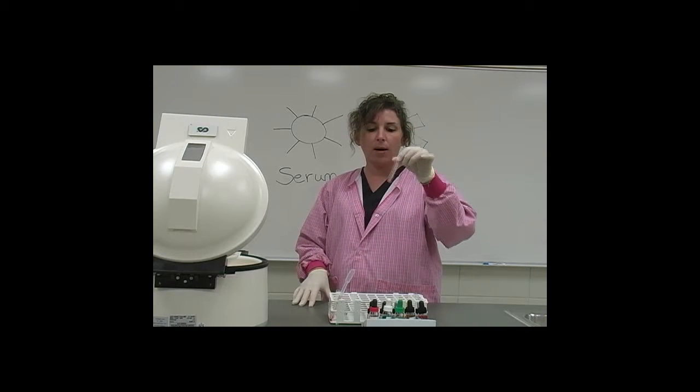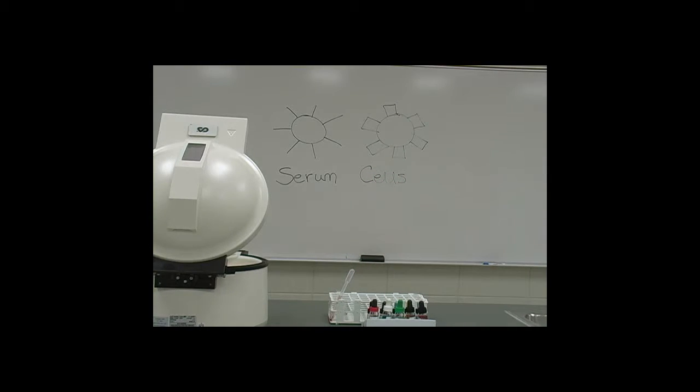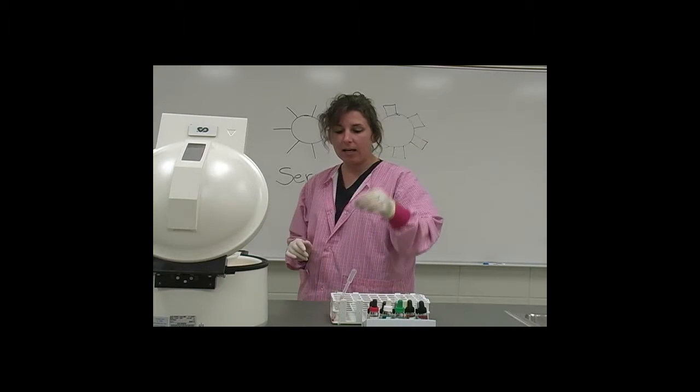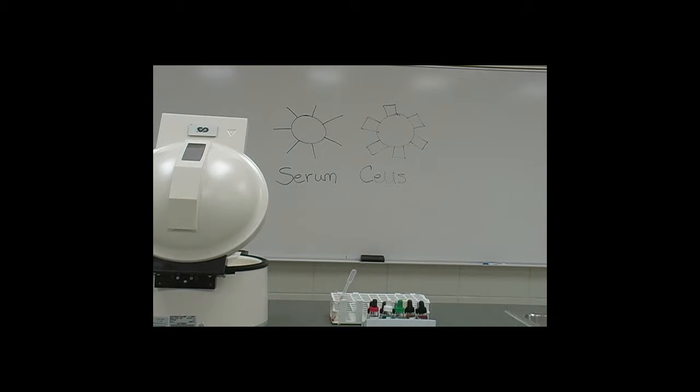Again, we'll do the same thing for our B. In this tube, I'll step around a little closer. You will notice that I have no clot in the tube. It's just a clear rolling drop of blood. And again in our D tube. And you can see it is depicted by a clot.